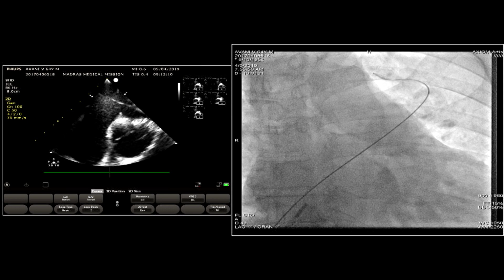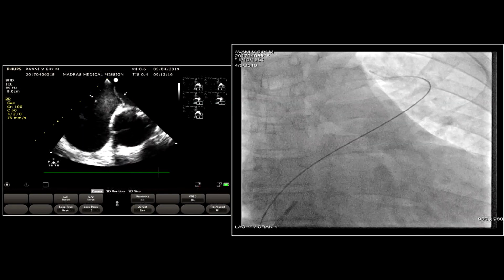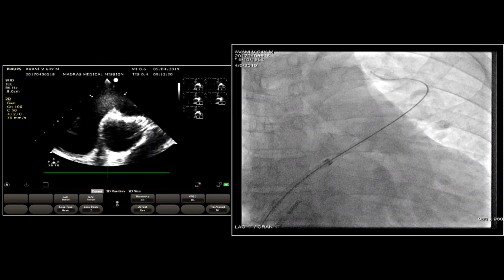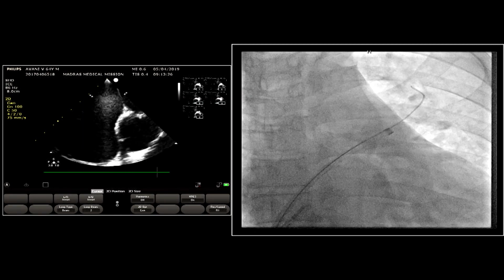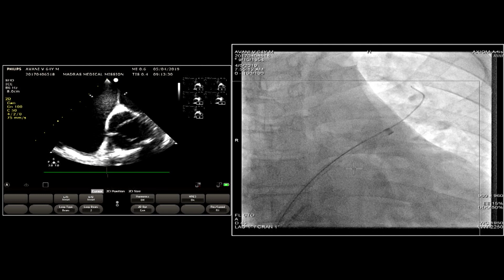Yeah, I agree with all of that. I guess I was just pointing out, you do have elevated PA pressures here, but in these patients who have a lot of left to right shunt, you often find the PVRI is very low. And so when I see a really good left to right shunt, I feel much happier. Yeah. So the second question is about the restrictive left ventricular physiology.